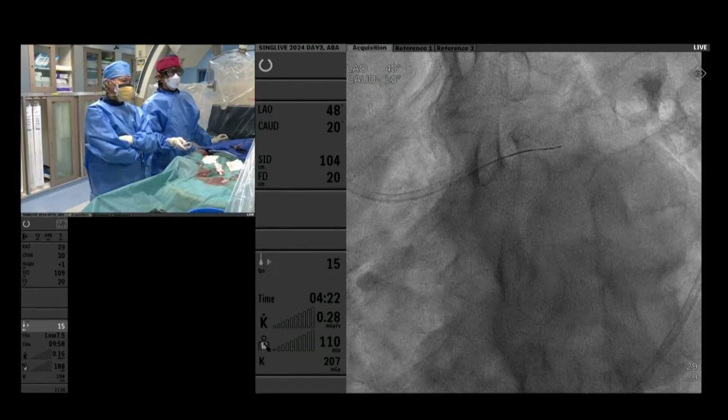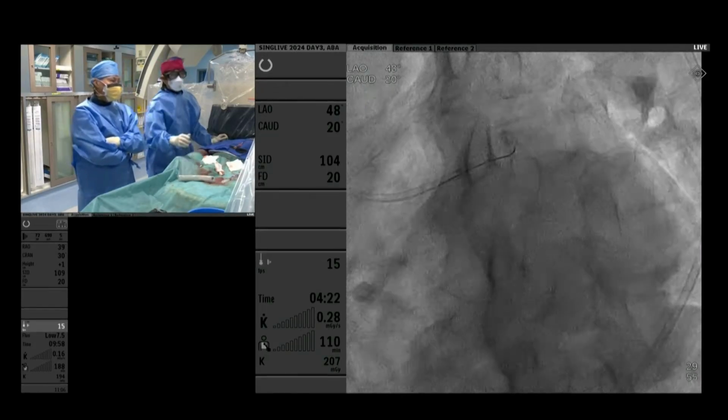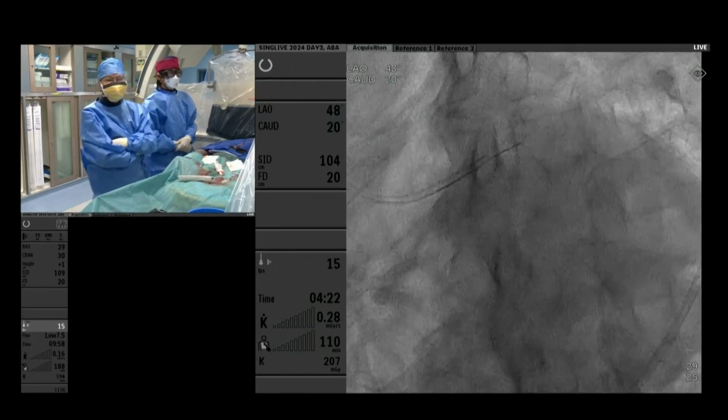Next, this is some of the wiring. We had the roadmap of the previous NGO. So maybe, Jonathan, before we go into that, maybe we can let KK and the panel tell us what they would consider will be the right approach for this patient.